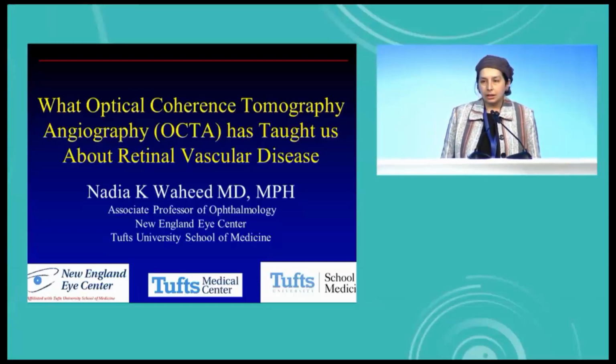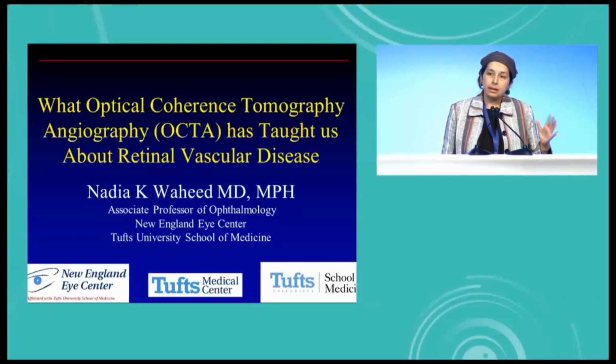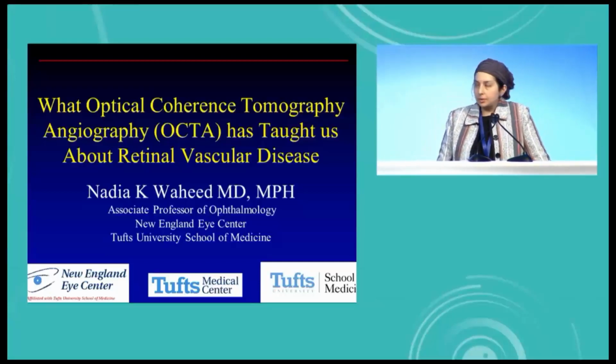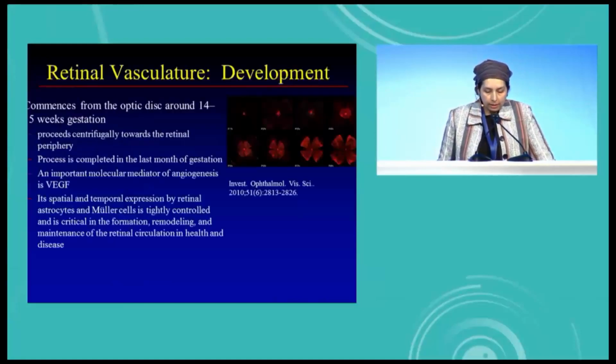So I'm just going to rapidly run through what OCT angiography has taught us about retinal vascular diseases. And of course, the king of retinal vascular diseases would be diabetes. So most of my talk is focused on diabetic retinopathy. Here are my financial disclosures.